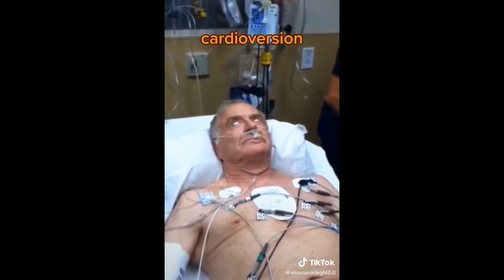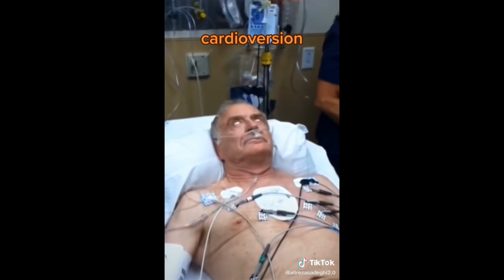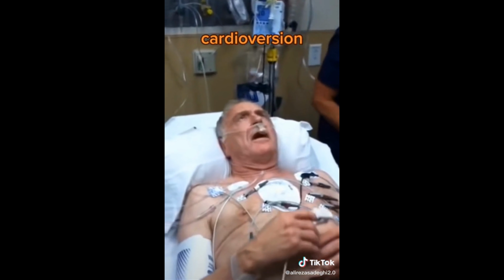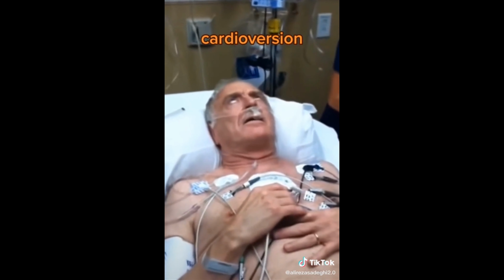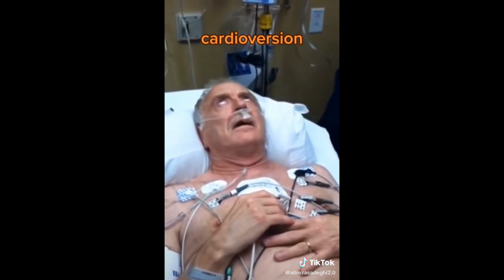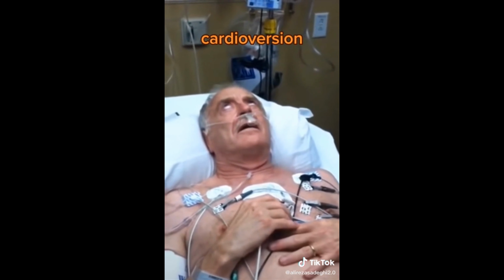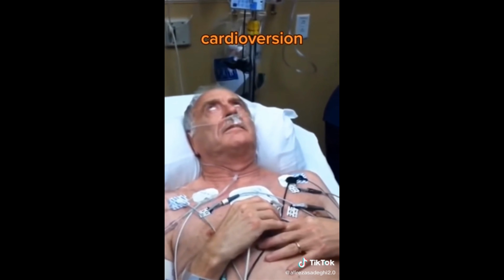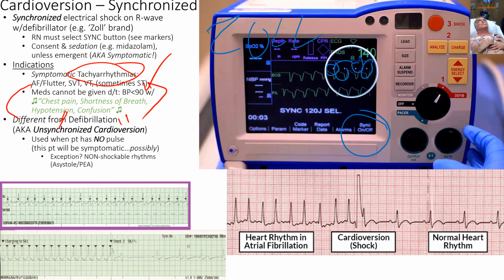All right. Go ahead. So he's confused. Okay, hold it down. There it is. All right, so he might need another shock, but he's not going to remember this because usually sedation has amnesia effects. So they're not going to remember that, which is nice.